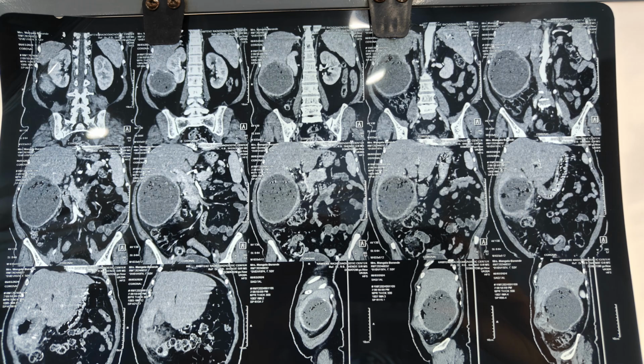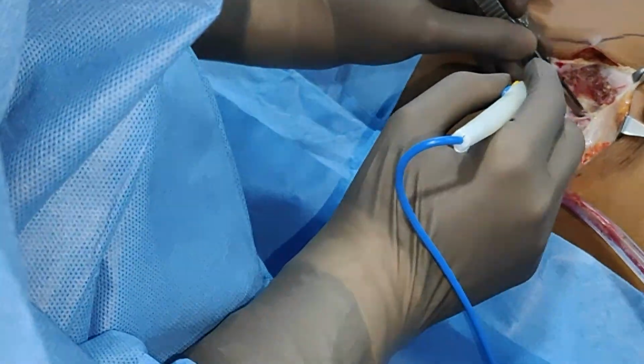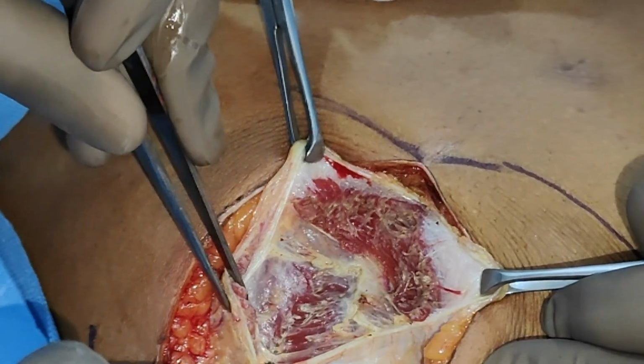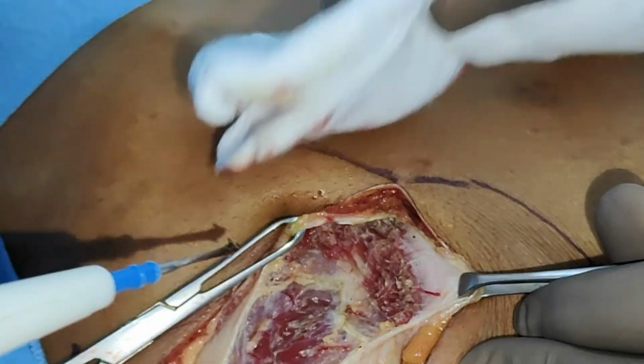As you can notice in the CT scan, a large cyst with collection of gas. This was the palpable lump this female had. And we planned for an open exploration and a wide deroofing of this infected liver cyst. The right subcostal incision was taken exactly over the site where we could palpate the cyst.